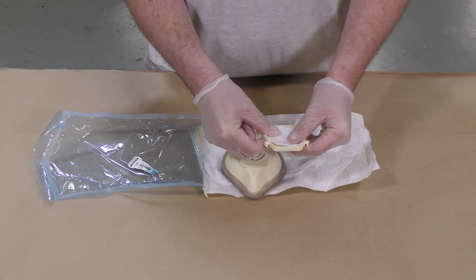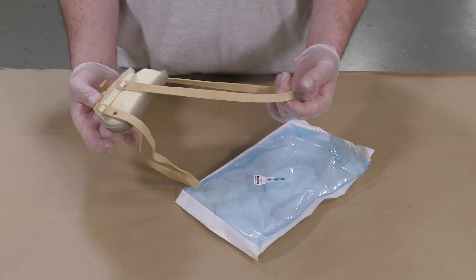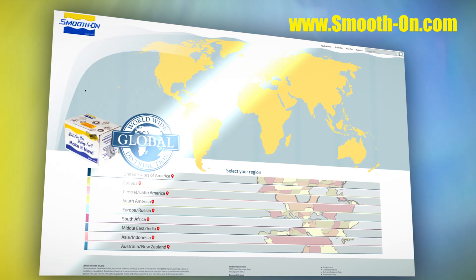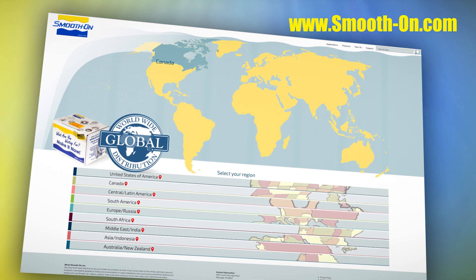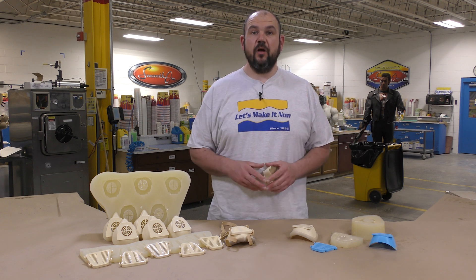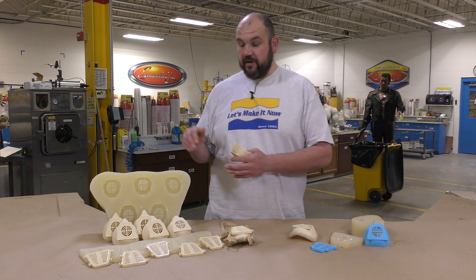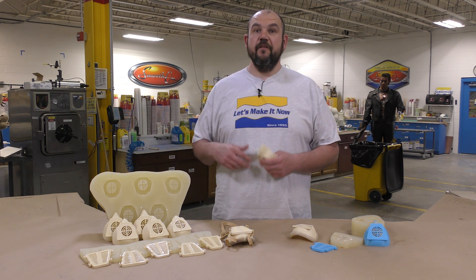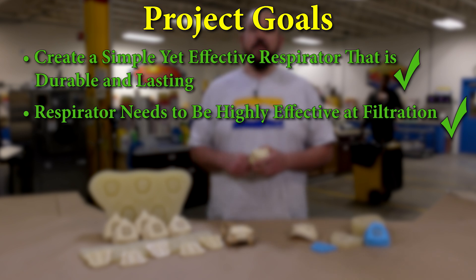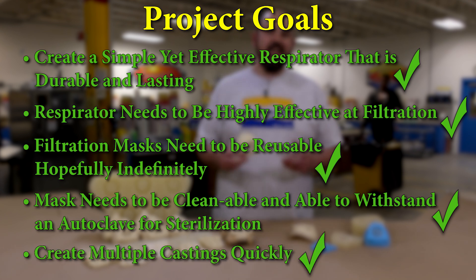The mask itself can be reassembled together — make sure to use a clean new filter. This respirator is now certified sterile and ready to be used. We went from a 3D model to create a mold so that we can create multiple castings using a gang mold very quickly. Most importantly, we created a simple yet effective respirator with highly efficient filtration that you can actually clean and reuse — clean it, autoclave it, sterilize it, and then reuse it.